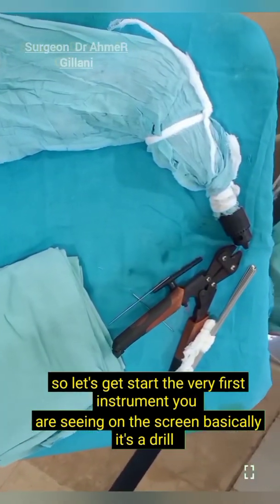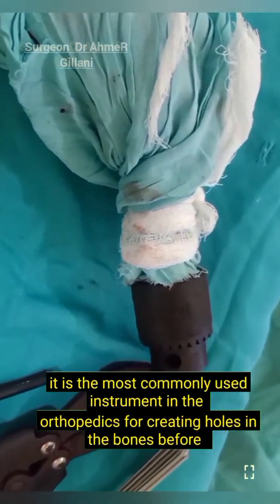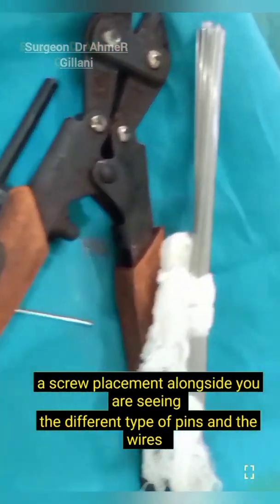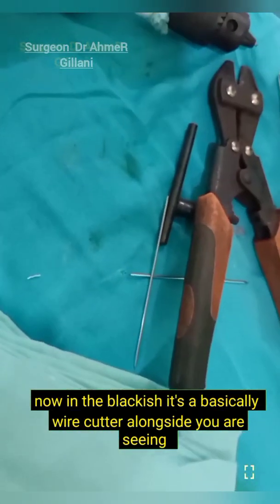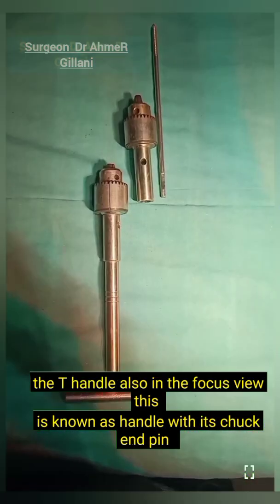The very first instrument you are seeing on the screen is basically a drill. It is the most commonly used instrument in orthopedics for creating holes in the bones before screw placement. Alongside you are seeing different types of pins and wires. In the blackish color, it is basically a wire cutter. Alongside you are also seeing the T-handle in the focused view.